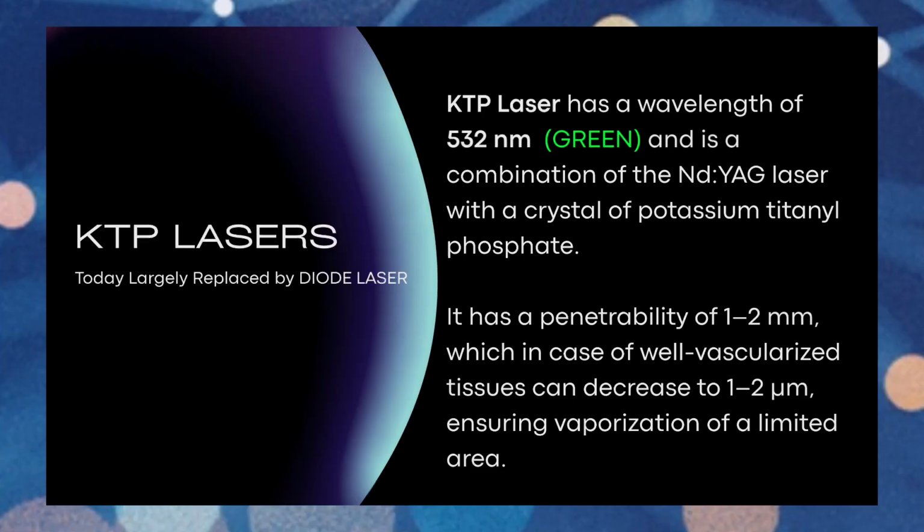Back to the CO2 laser for a second. We published a study. If you go to my website through my CV and list, you will see a published study on the safety of the CO2 in an animal model. We hit the same open cochleostomy repeatedly over 10 times without any effects on cochlear nerve action potentials or any effects on the hearing of the animals. So it's extremely safe. But in these, you have this additional risk about the fact that it's not absorbed by water. And KTP was quite nice and quite popular.